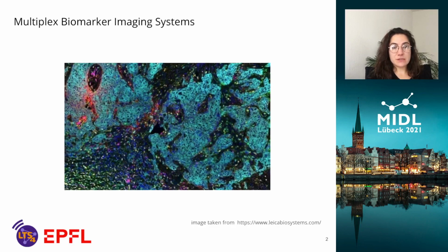Thanks to recent advances, multiplex imaging allows for easier multi-label analysis of tissue biopsy samples, enabling the study of complex spatial biology within the tumor and the tumor microenvironment. However, very often, with this technology, the biopsies are scanned first at a very low spatial resolution, and guided by experts, some regions of interest are scanned a second time at a higher resolution that gives us the opportunity to do cell-level analysis.